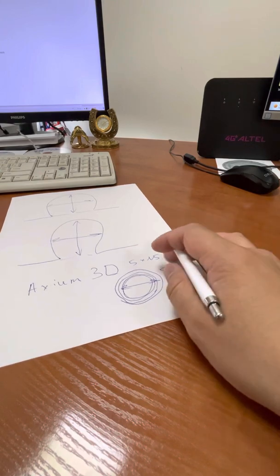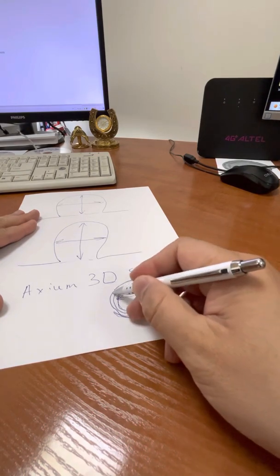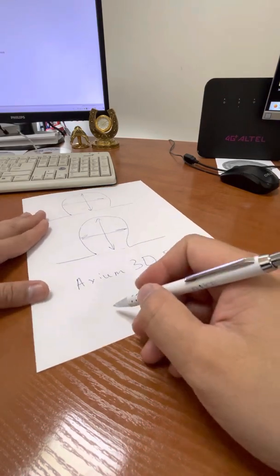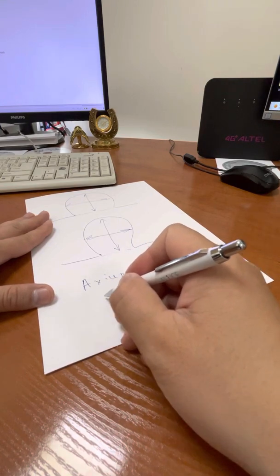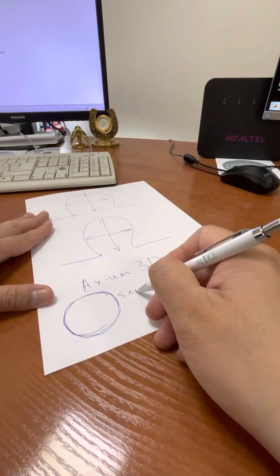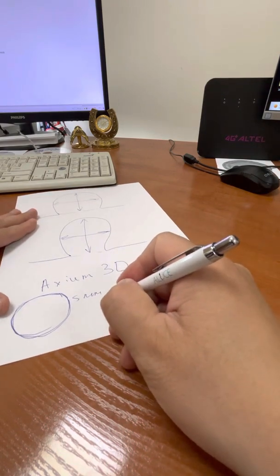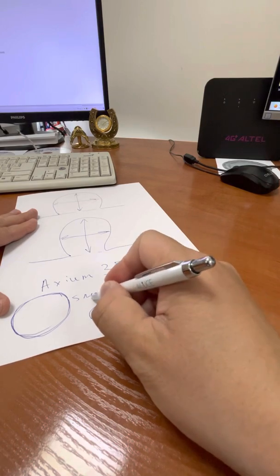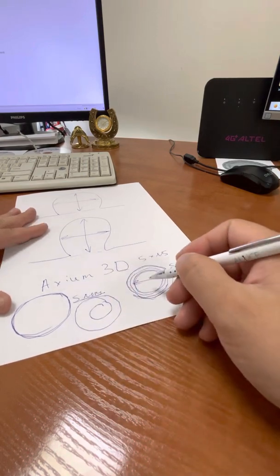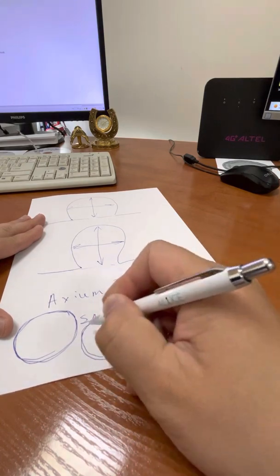And it's very important when you start to coil the aneurysm, you start to fill the space, and the next loops of the coil should be smaller. And all other types of coils usually, if it's helical, it becomes the same 5 millimeter, or the Optima coil from Balt, the first loop usually small, and the next loops are at the size of the aneurysm, at the size of the coil marked on the box.